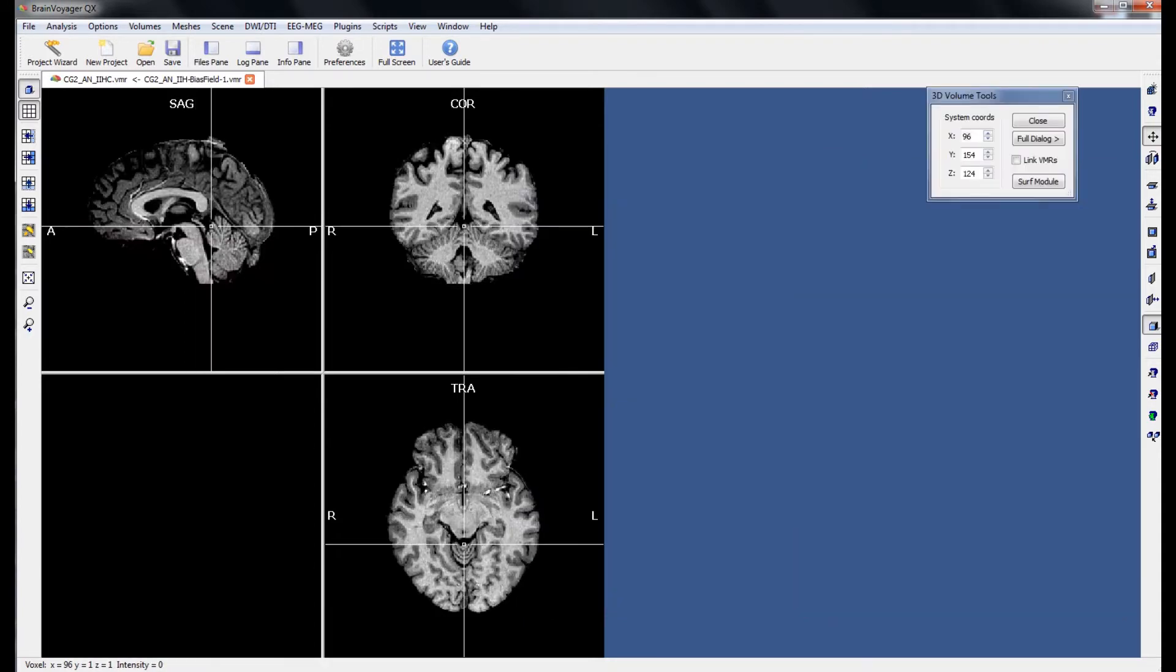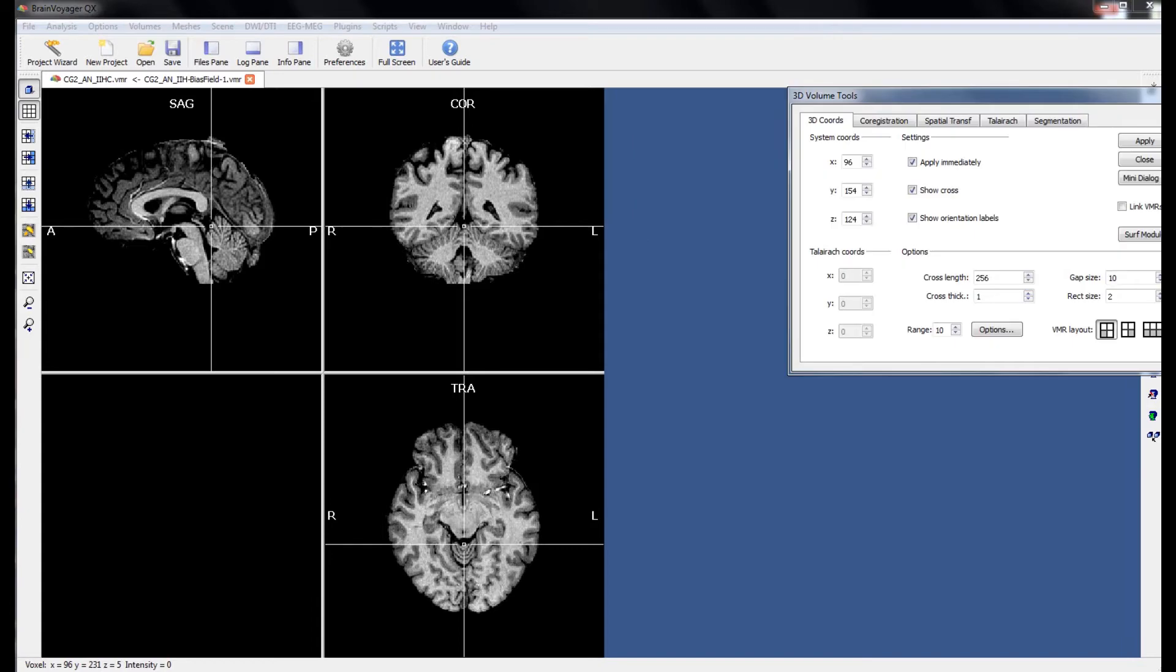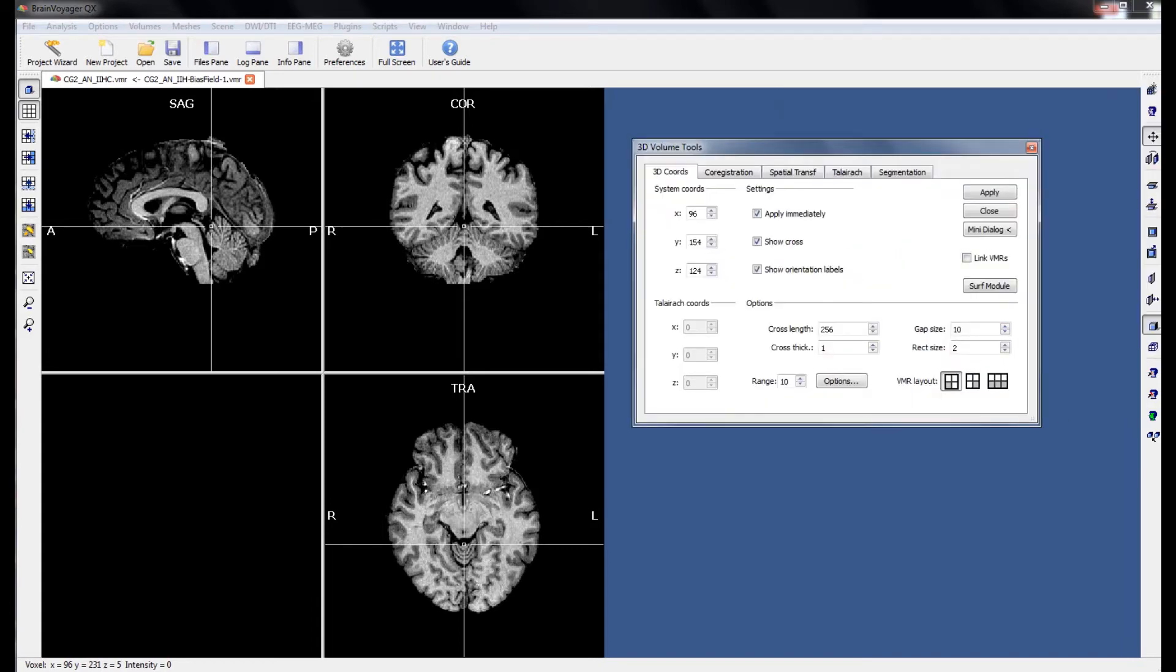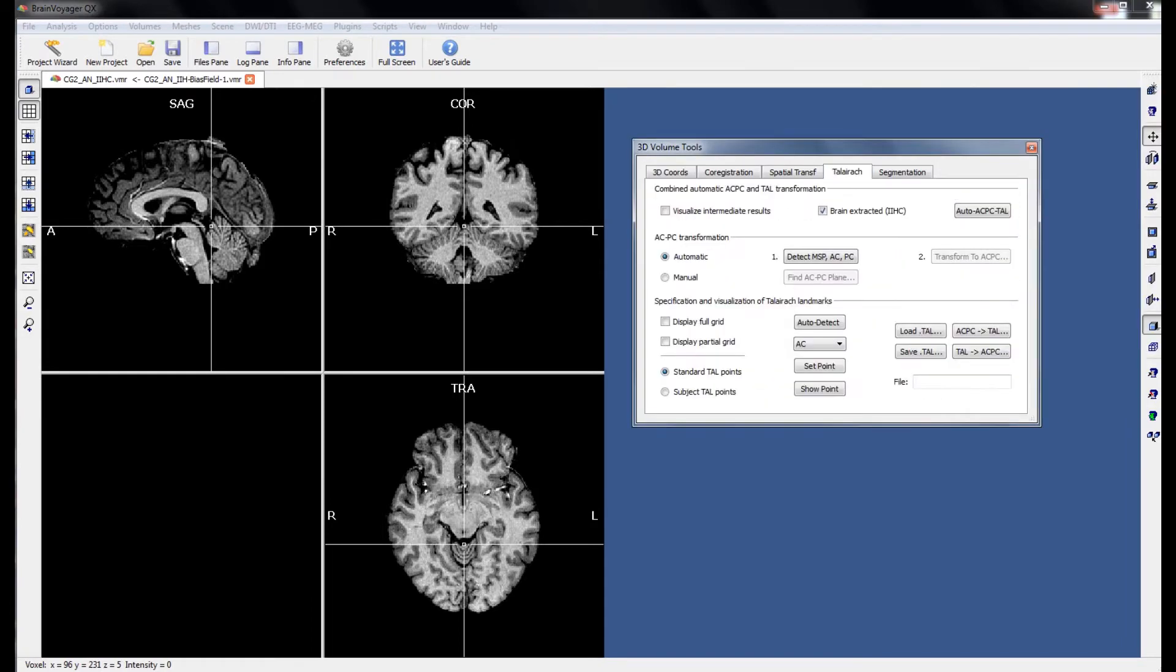The next step is to convert our brain from anatomical space into ACPC space. To do this we want to go to our 3D volume tools and click on the Talairach tab. This is a process we want to do manually so we know that we get it correct. So if we switch to manual mode, the first step is to define the AC point or the anterior commissure.